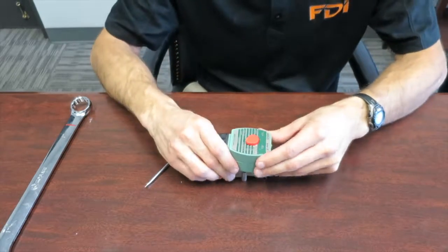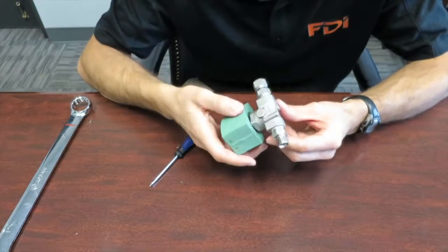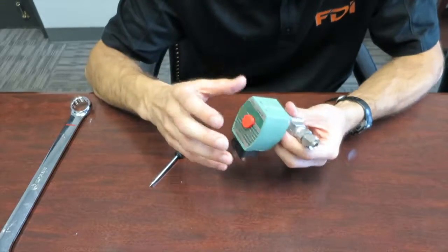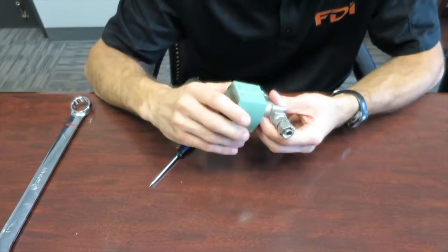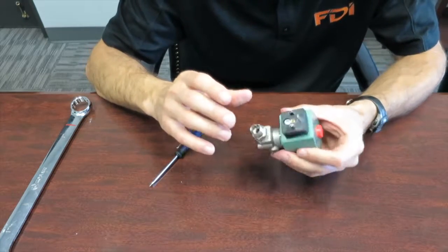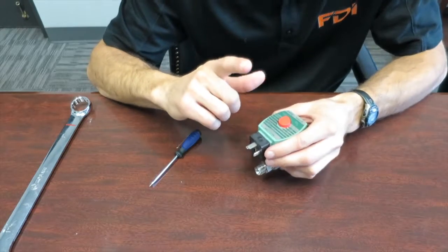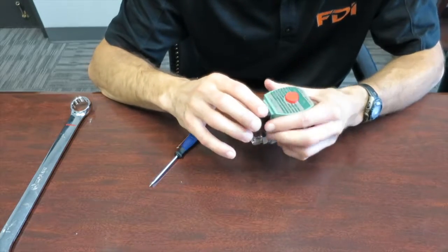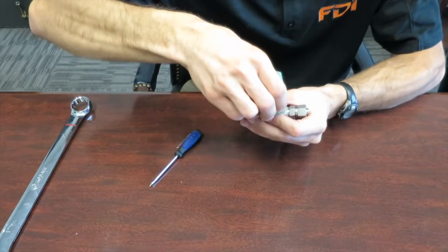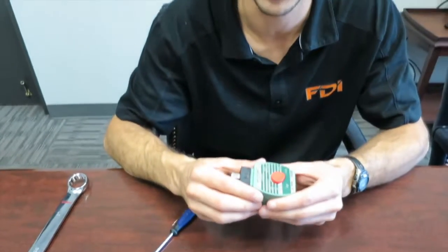That's it for the ASCO solenoid valve replacement and inspection. If you're having any symptoms that suggest the valve is leaking, you can take it apart and inspect it. One last troubleshooting technique: if this valve is engaged during a cycle, you can feel it and it should vibrate a little bit — a low vibration. That can be another troubleshooting technique you can use.